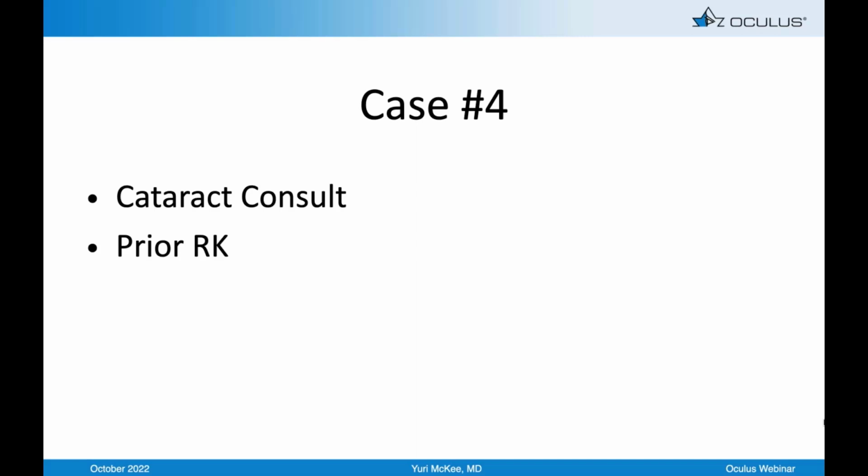Okay. Well, you answered the first question that I have here. It says, how do you differentiate high order aberrations based on pupil size? And I think you commented on it. You fix things at 6 millimeters when you make comparison. Is that correct? Yes. So higher order aberrations are completely pupil dependent. And when we speak amongst each other as professionals, we have to have a standard language. And so that's a 6 millimeter pupil size.